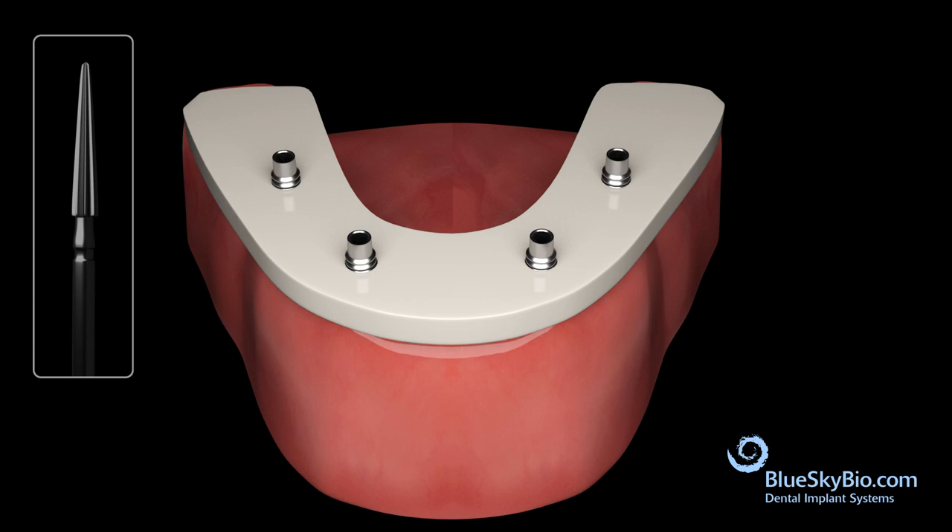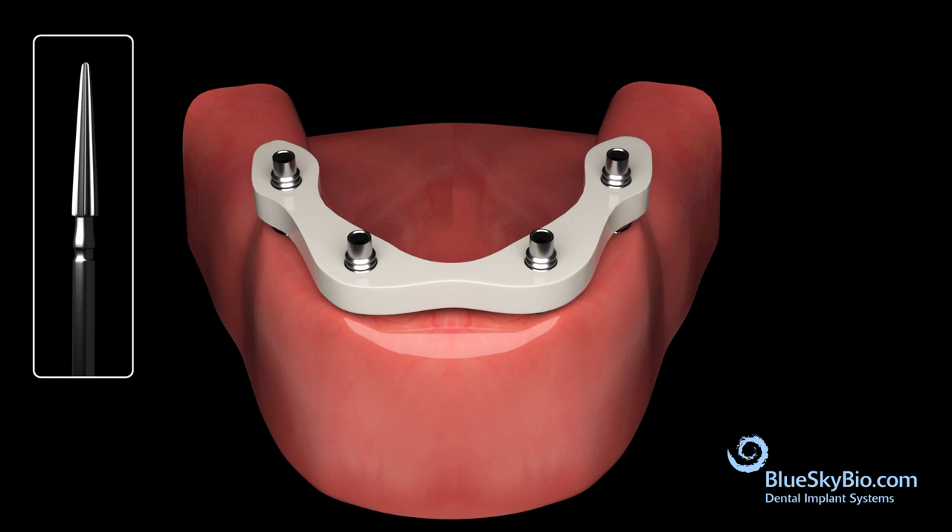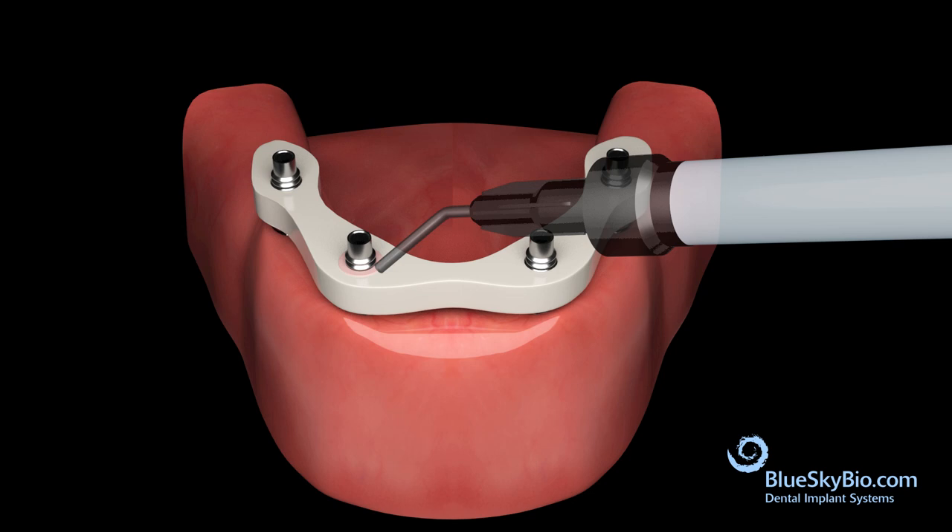Using a burr, trim down the Trilor arch bar. Pick up the cylinders in the Trilor bar using a resin cement such as Panavia. Once complete, they are cut down to flush with the top of the bar. Trim the underside of the bar.